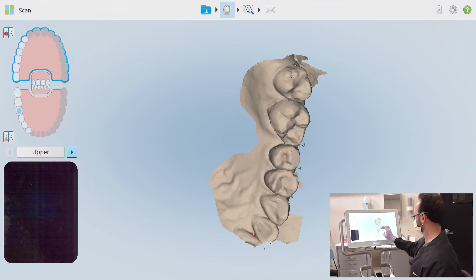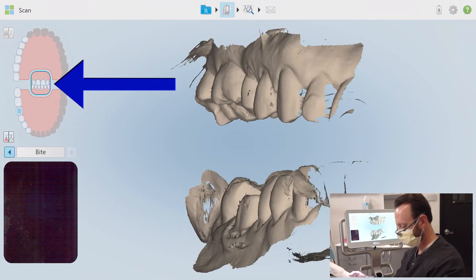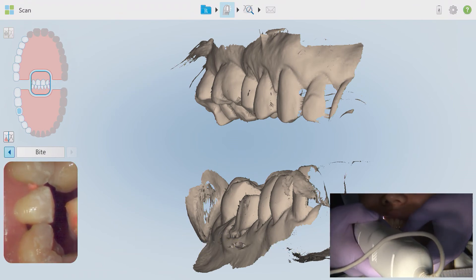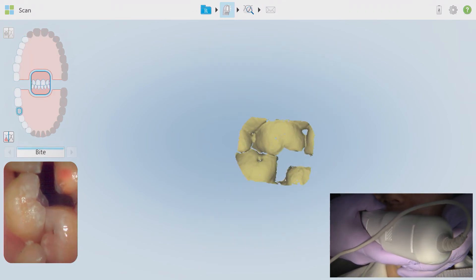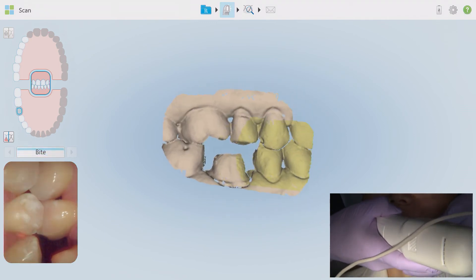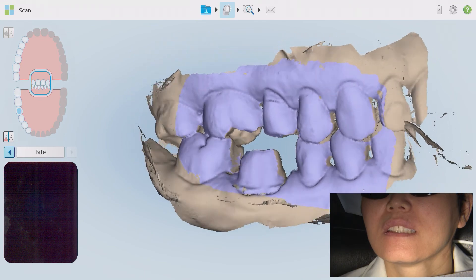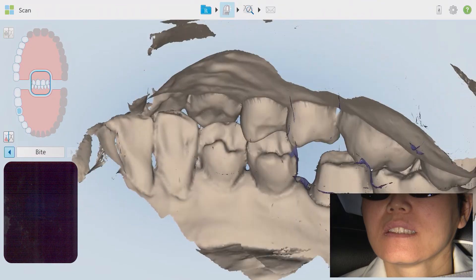Now let's bite these quadrants together. Click on the bite registration button in the chart and the quads will appear opposite each other. I'll ask the patient to open, insert the wand in the vestibule, and then ask the patient to bite into centric occlusion — I may even help to hold their bite together with a little pressure on the chin from my stabilizing hand. I'm starting posterior and facing directly at the buccal surface of the arches. This scan is taken in an S or zigzag pattern moving towards the anterior until the quads mesh. Stop the scan as soon as this mesh happens and review it.